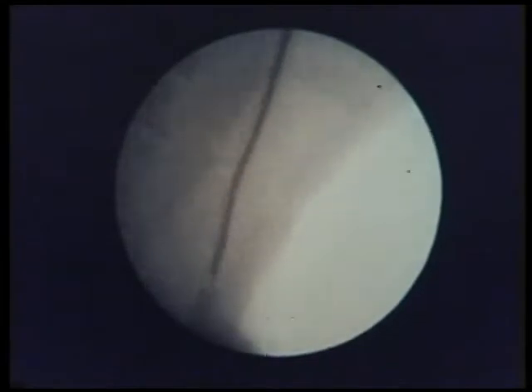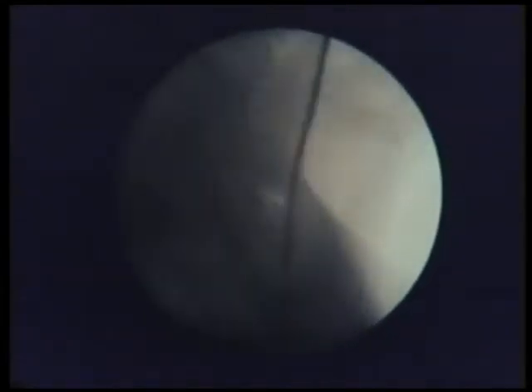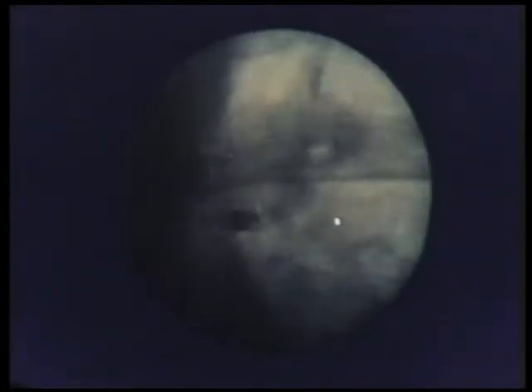At this juncture, the patient is turned to face the examiner. The descent of the tip of the catheter as far as the bifurcation can easily be observed in the trachea. On the left side, close to the trachea, the pulsation of the aorta can be observed. The guiding sound is now removed. The terminal portion of the catheter then regains its original curve and passes into the left main bronchus and the upper lobe bronchus.